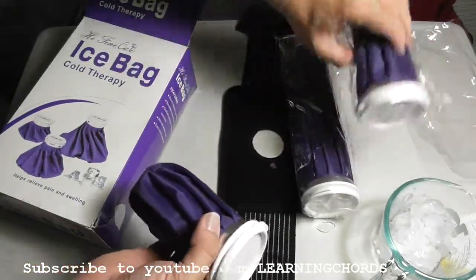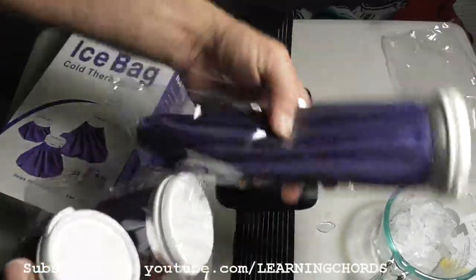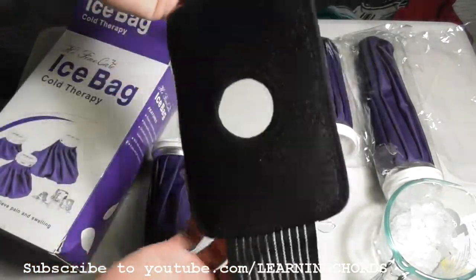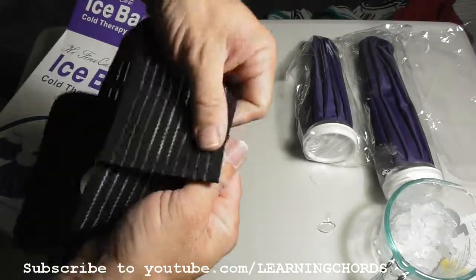Again, this is the 6 inch. This is the 9 inch that I have not used yet. This is the 11 inch, and it also comes with a strap to hold the ice bag in place — it has Velcro fittings.